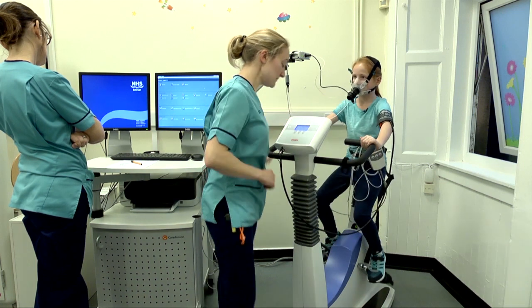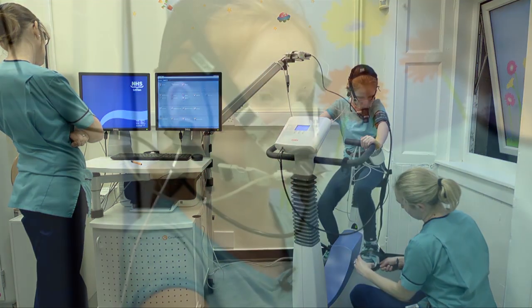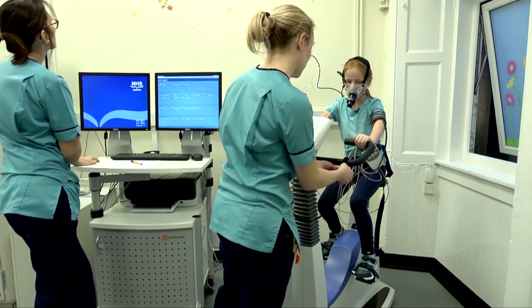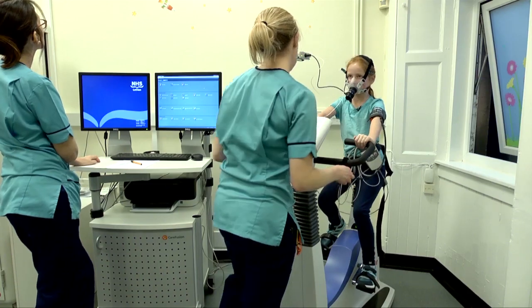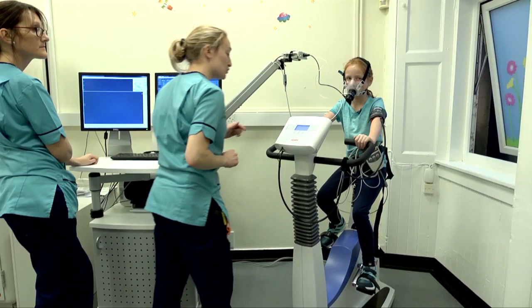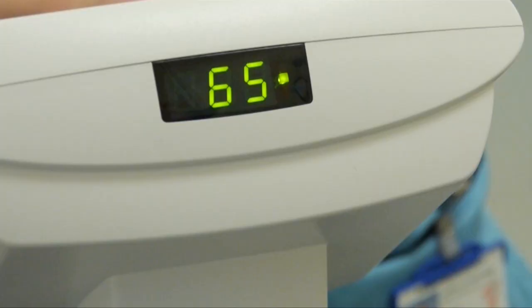There we go. And we'll get your feet strapped in nice and tight. We'll get you sitting still for the first few minutes doing absolutely nothing — that's just so we can see what it's like normally, how fast your heart's going and things like that. This number here tells you how many times you've turned the pedals in a minute, and what we want to do is keep that number as close as we can to 65.